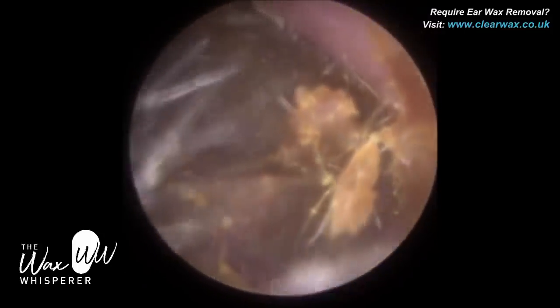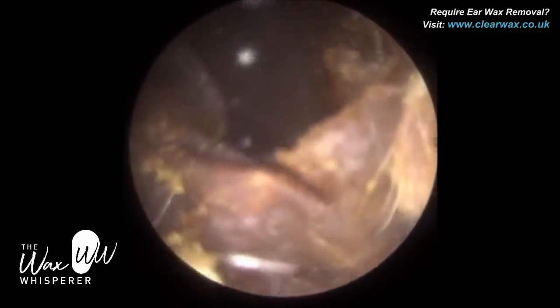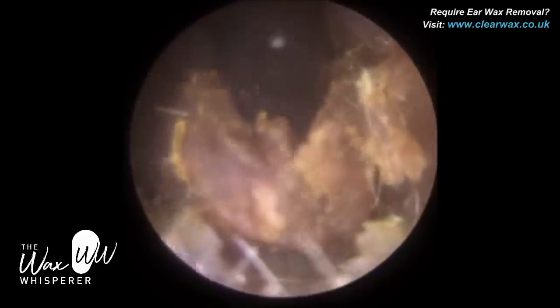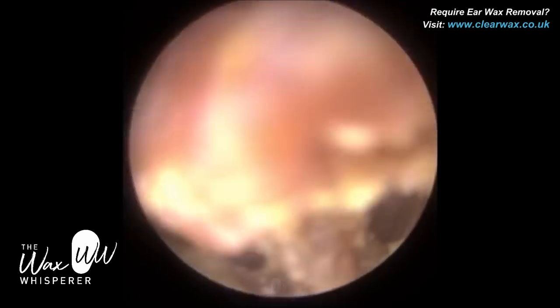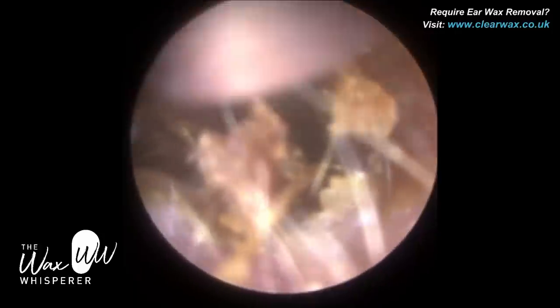You can see I'm kind of funneling, tunneling through the wax. The jobson horn has been quite useful at this stage. Because we're on the outer third, the cartilaginous portion, if we do come in contact with the canal wall, it's less sensitive for the patient. If this curette or ear hook comes in contact with the inner two-thirds of the ear canal — the bony part — it can be very uncomfortable for the patient. So we do have to be a bit more cautious.